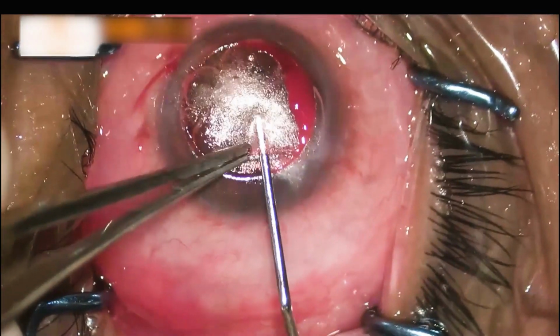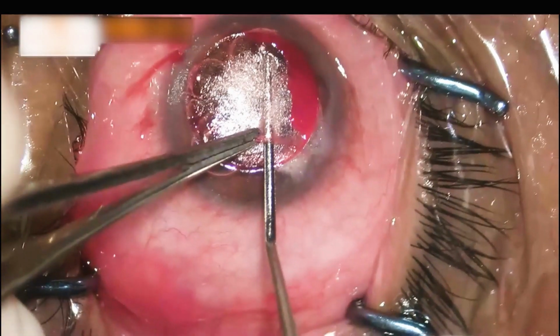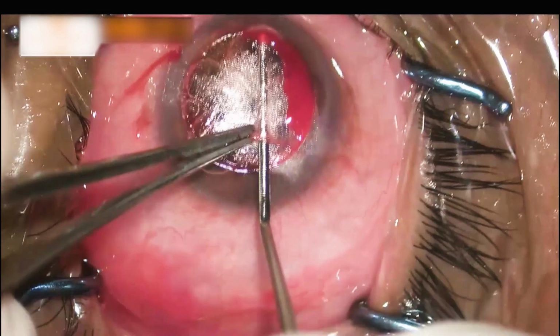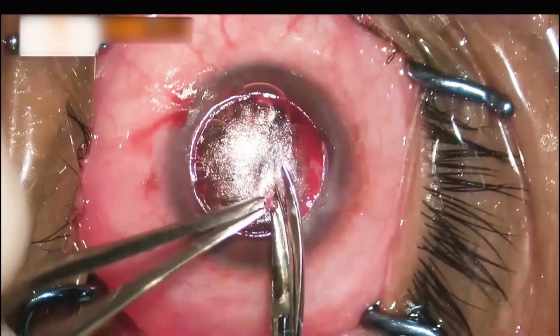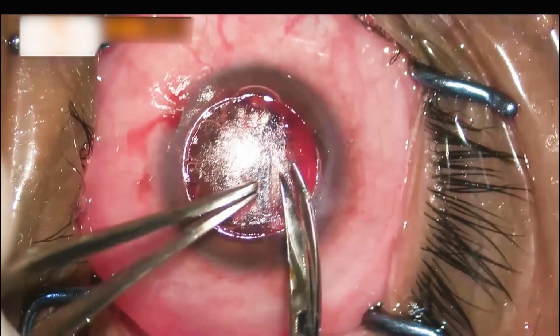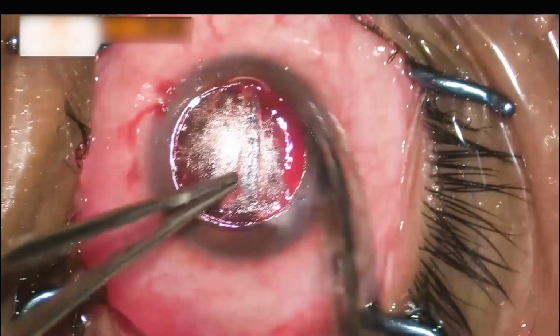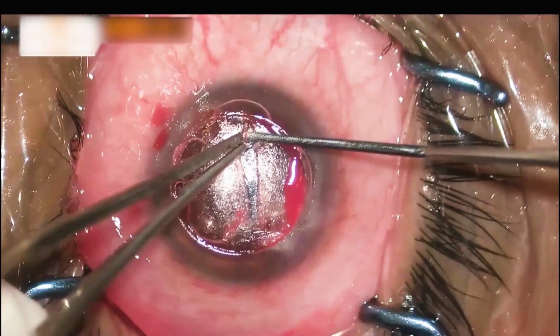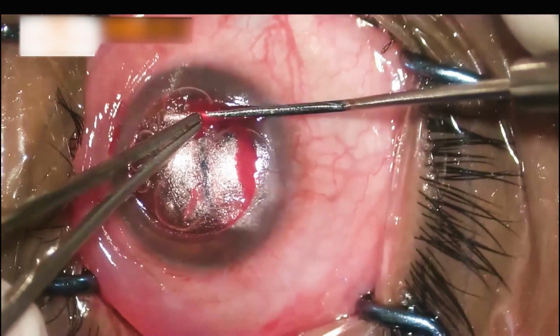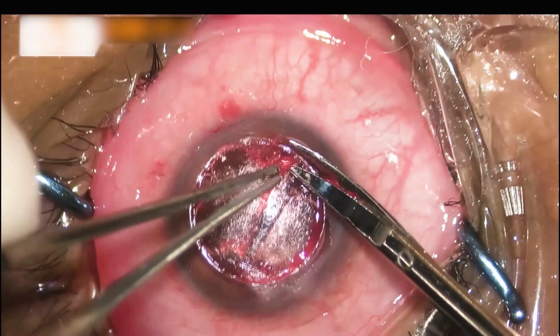A blunt dissector is used to delaminate the stromal lamella. Vannas scissors is used to dissect out the stromal lamella. The blunt dissector is grooved under the stroma to achieve the stromal dissection and reach the predescemet layer.